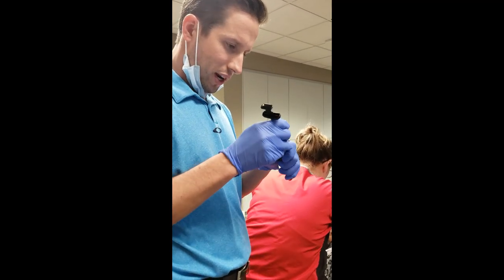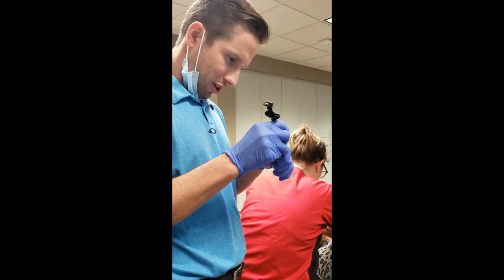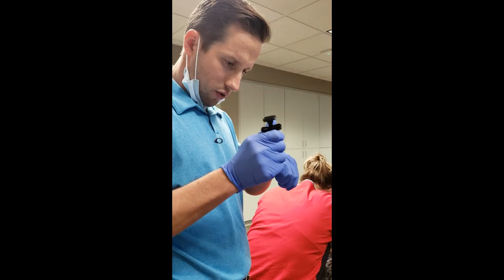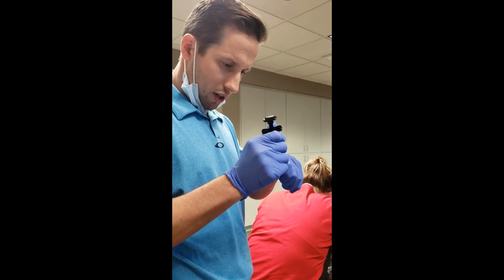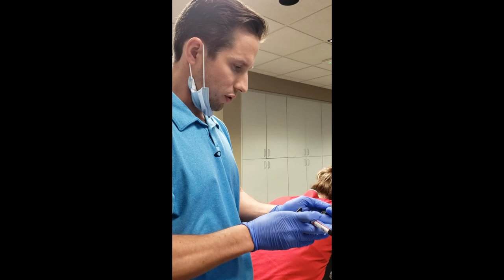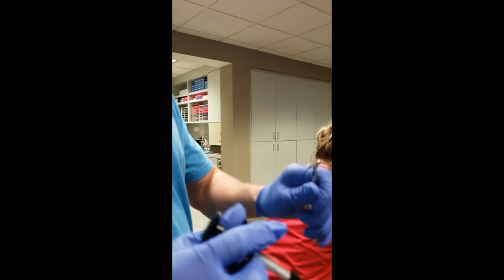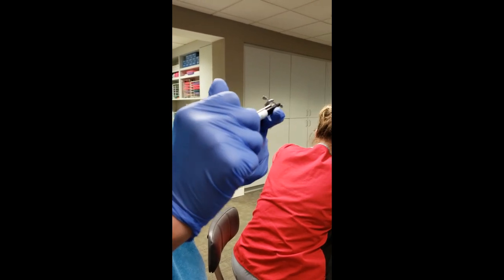Today we're putting on my favorite appliance - the Motion Appliance. Motion Appliance is a Class 2 corrector; we have a video about it if you're really interested. Here I'm just going to show you the process for applying it. Ideally we like to have the motion appliance loaded before we have the patient back.